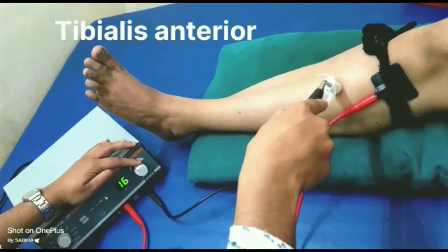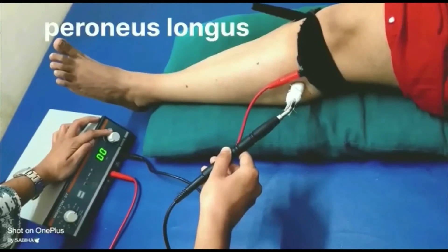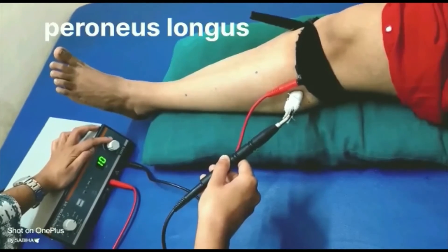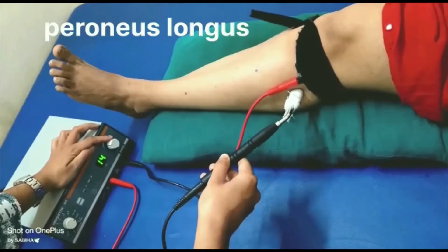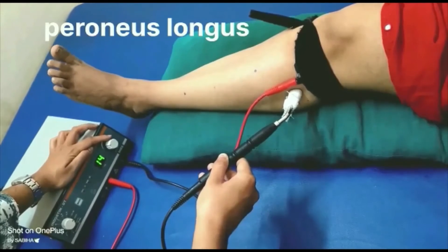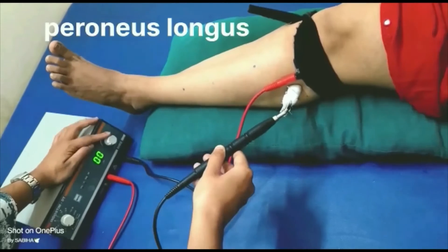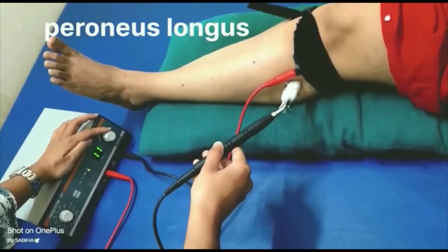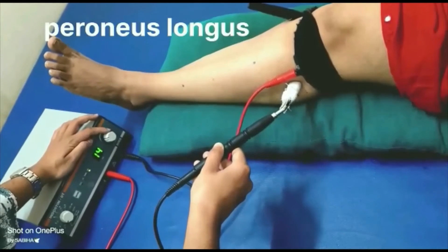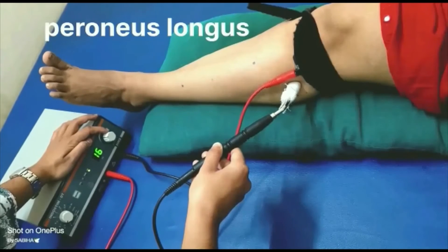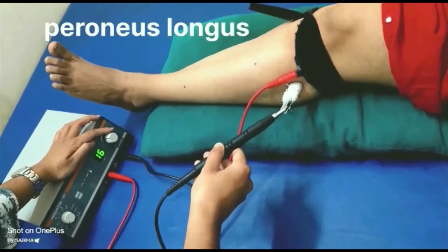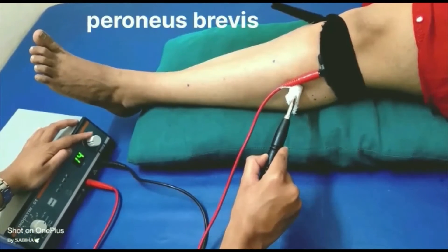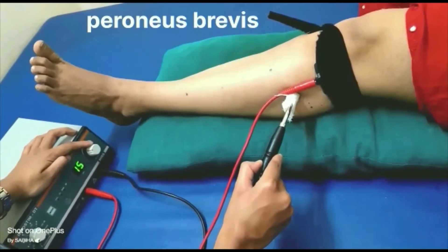Reduce the intensity to zero. Switch to SF mode with pulse duration of 0.3 milliseconds and increase the intensity gradually until minimal muscle contraction is visible, then reduce intensity to zero. For peroneus muscle: muscle response to IG is noted, followed by muscle response to SF.